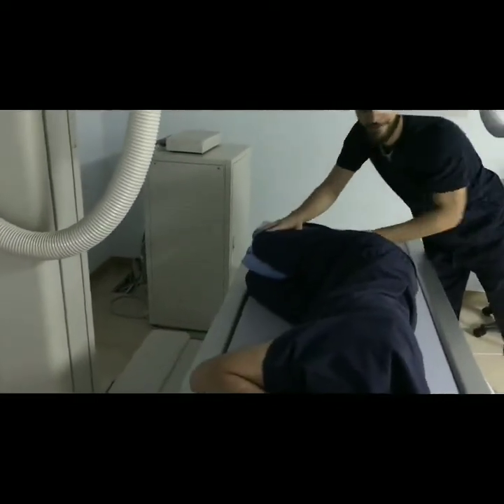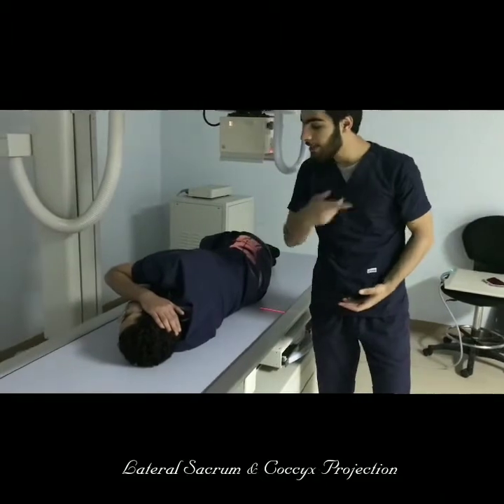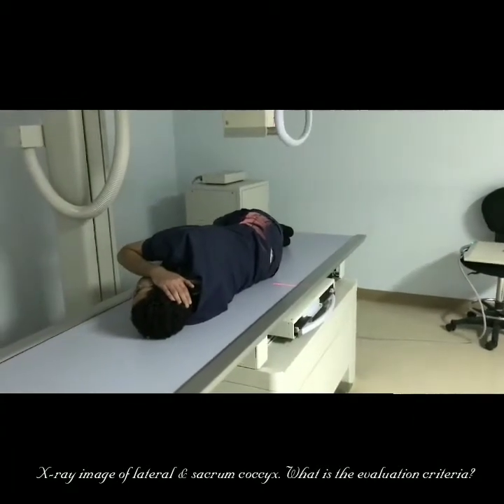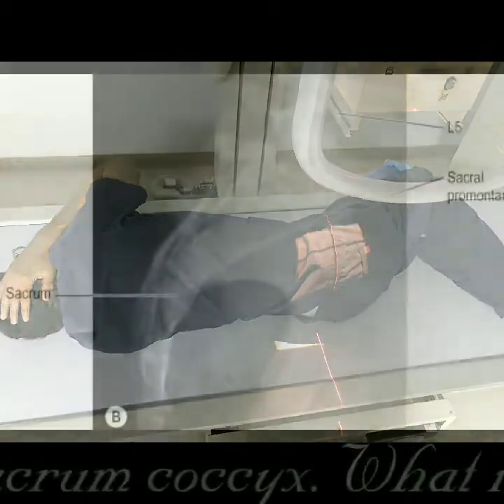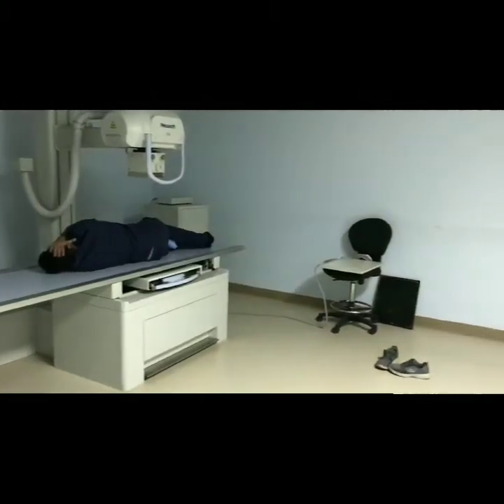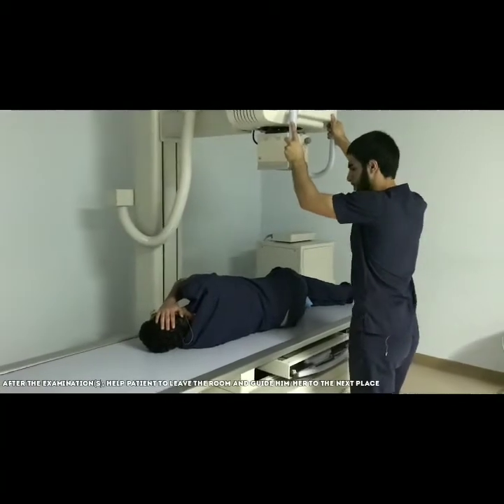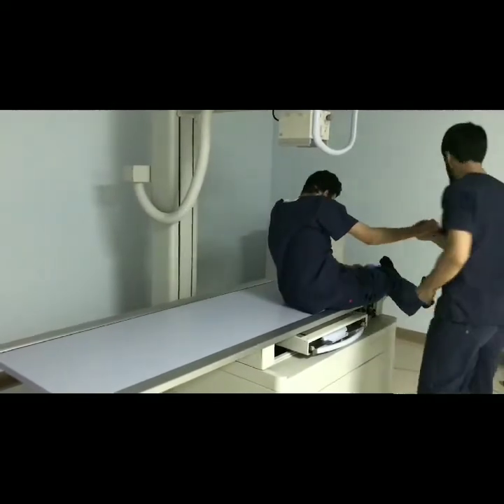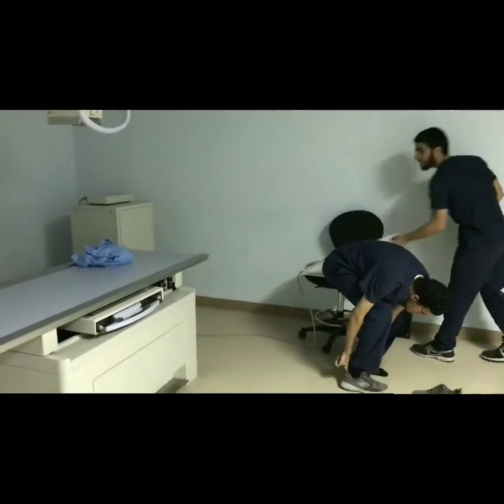Place the support for patient comfort. Shielding is optimal if possibly achieved. After you've done all of the routine procedures, come back and take the x-ray tube higher for both patient and machine safety. Aid the patient getting up. At this point, direct the patient to the next healthcare provider and ask the patient if he has any further concerns.